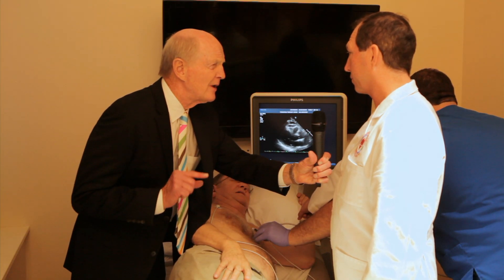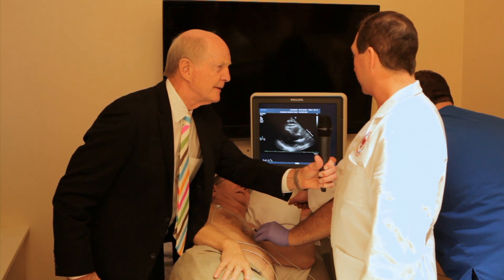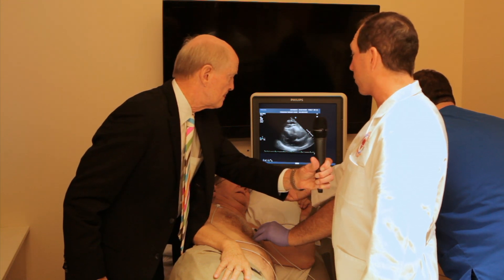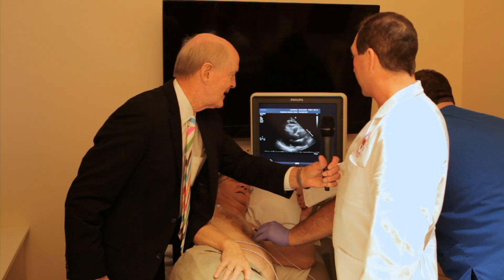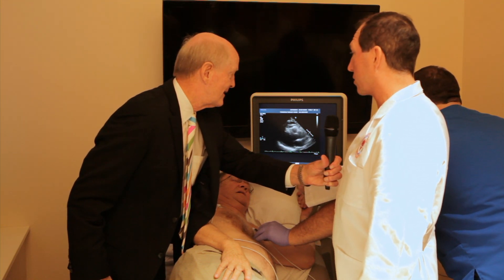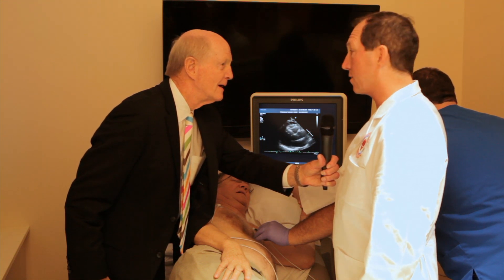Now can you tell if that aortic valve is leaking just by looking at this? We can. If the valve were thickened and narrowed and did not open properly, that would be stenosis. And then we apply color across there to see if there's any leakage — any back flow of blood — and he does not have either.